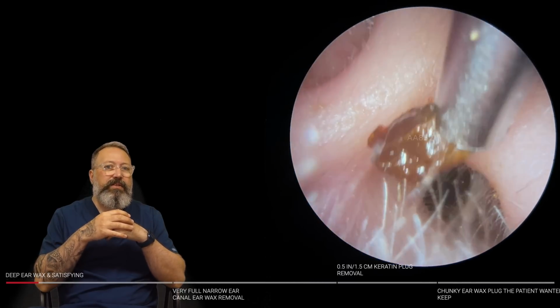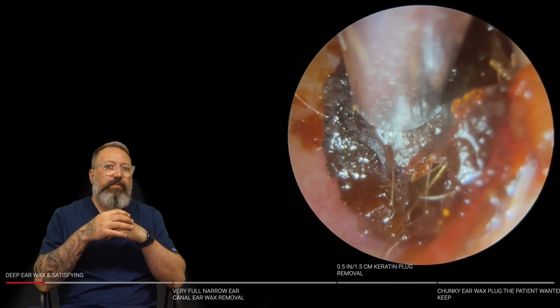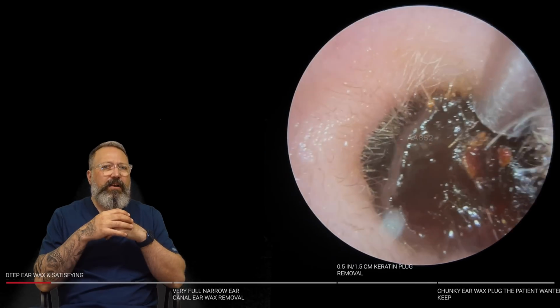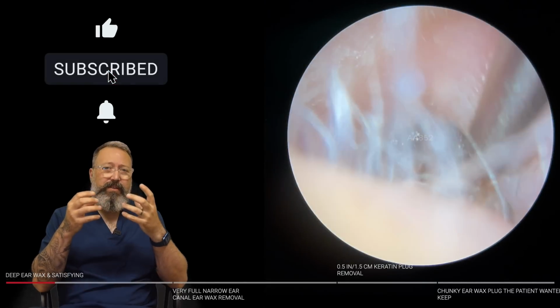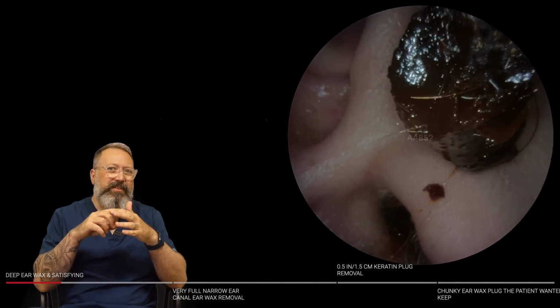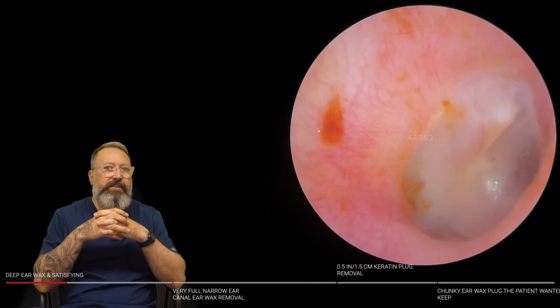So we're just removing these outer pieces first of all, and then we're going to get to that harder central core of wax here. There we go. Just going to start to pull this forwards. Out this is coming. There we go. It's got a little bit stuck, so we're just going to give this a bit of a wiggle. Now, sometimes what you'll get with these particular pieces of wax, when they've hardened up like that, sometimes they'll have a little bit of keratin that are still attached to on the inner part of the ear. So as you start to pull this out, it just stays attached to a little bit of keratin and just holds on to it, so it doesn't want to come out easily. But that looks like it's come away well. There you go, just tidying up these looser pieces. And there's the eardrum looking nice and healthy there as well.